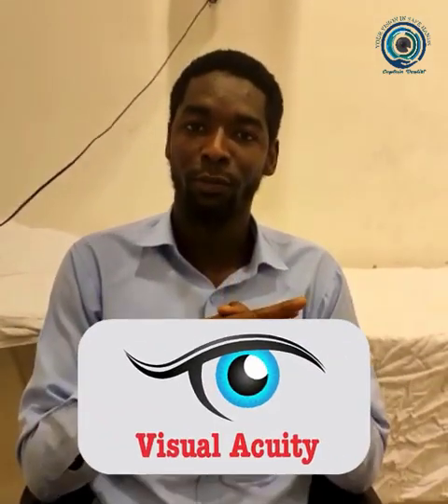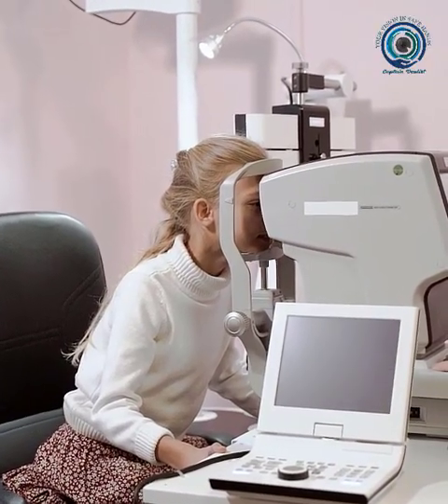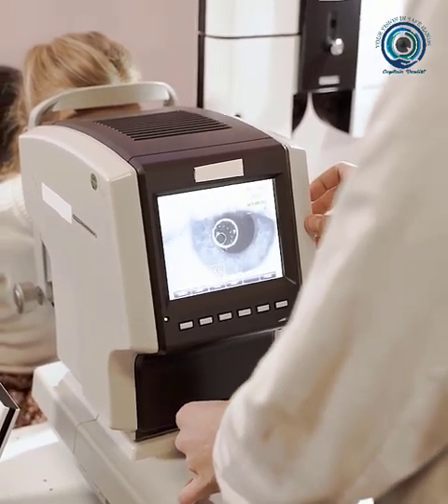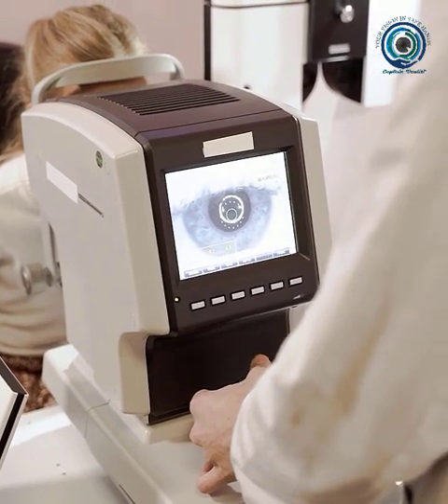Hi, I'm Abokora. Today we are going to discuss visual acuity. As you all know, visual acuity plays an important role in the field of optometry. As an optometrist, the basic step to ascertain the state of the eye is through visual acuity.